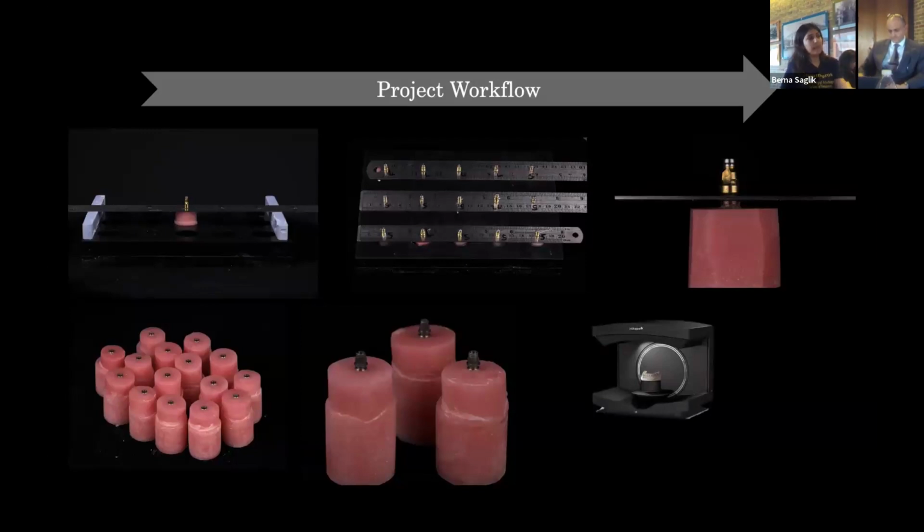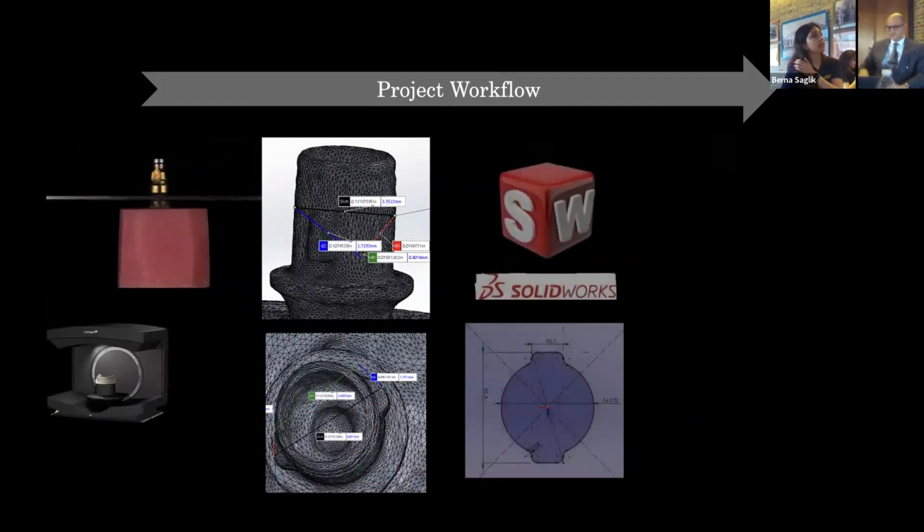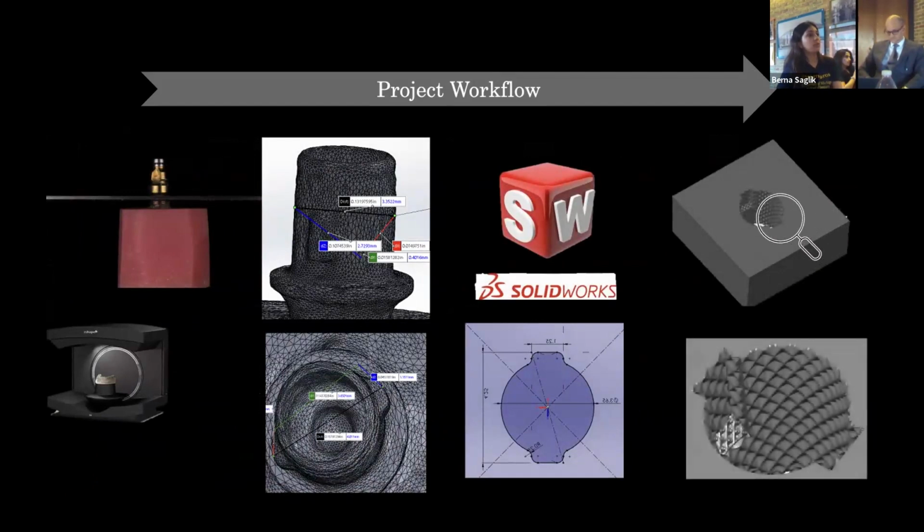For this tie base, we used an in-office scanner just to scan. From that scan, we can generate that STL file, and I think we worked closely with Dave over here. I think it was SolidWorks that we used, because that's what I was told. And then we did our design over here. It took us some time just to get to that design, but we finally made it. This is the 3D sample that we made, and this is how it looks on the inside. As you can see, those inverted pyramids, it's really hard to see in real life. I think you have to zoom in.